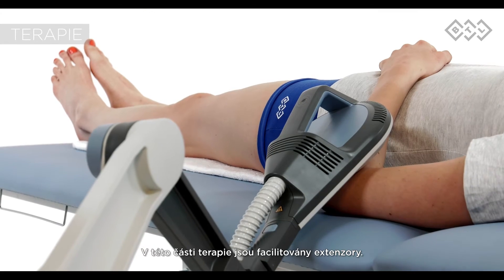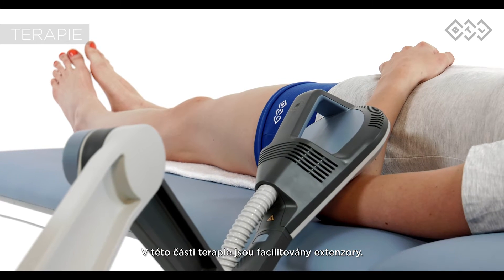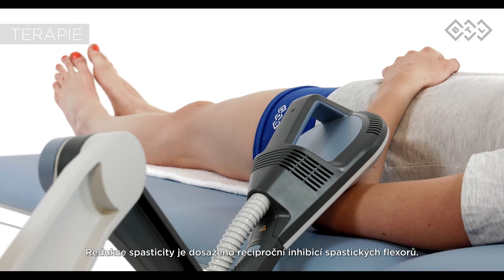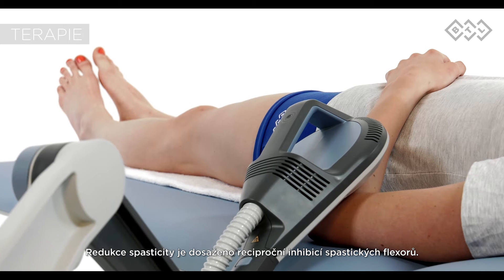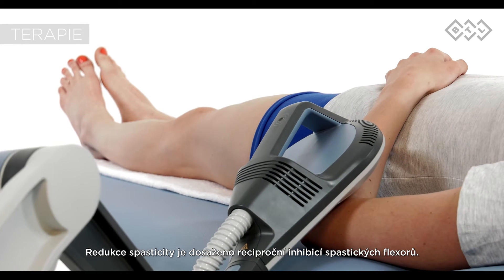In this part of the therapy, the antagonistic extensor muscles are facilitated. Together with the reciprocal inhibition of the flexors, spasticity reduction is achieved.